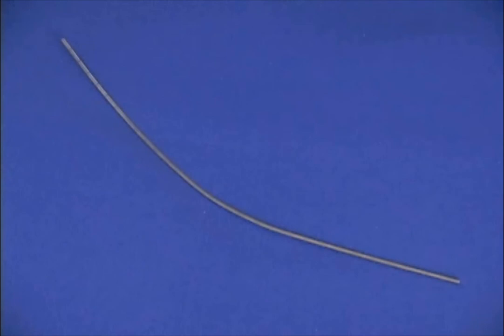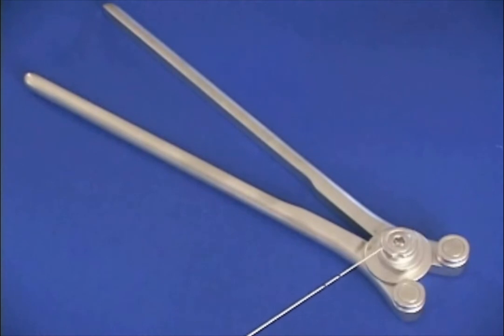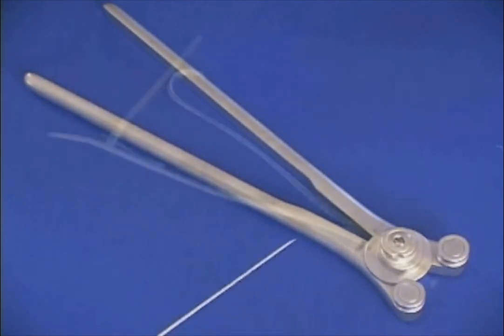The malleable rod template can be utilized to verify both the length and the contour of the rod prior to rod insertion. The rod bender can be utilized to contour the rod to a small, medium, or large radius. The center cam is positioned to the desired radius prior to contouring.